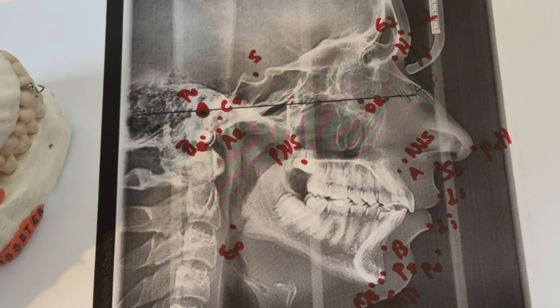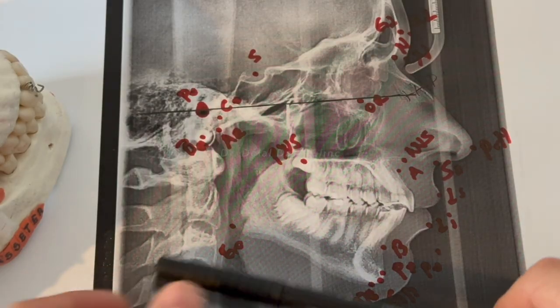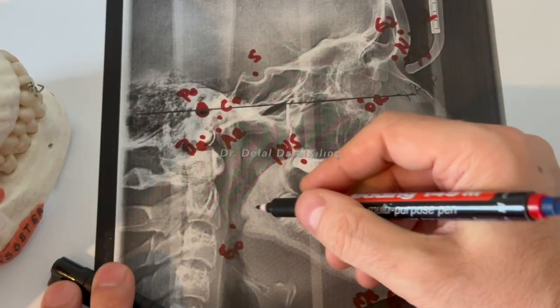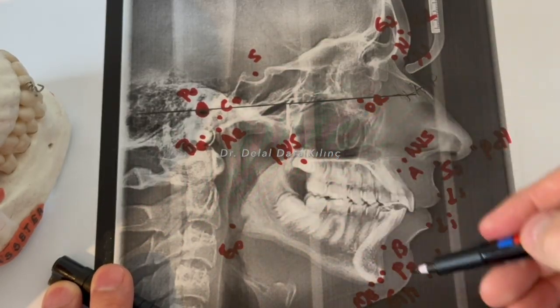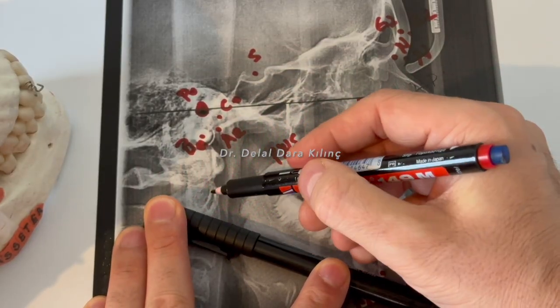Now let's draw the other two most used planes in orthodontics. One of them is the Gonion-Menton, the mandibular plane, just passing through from the point Gonion and point Menton. It's here, Gonion-Menton.